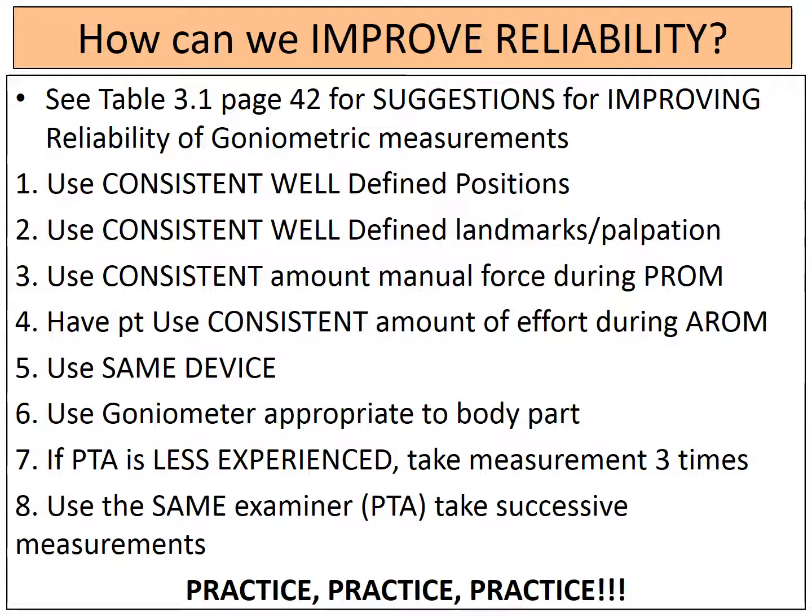You want to think about if you are doing passive range of motion that you are using the same amount of force to get at that end range of motion. Where it might become a little bit complicated is if your patient's in pain and how much are you going to push to get to that end range of motion. And if you're measuring it actively, is your patient giving you the same effort every time? And that's another thing that you want to encourage so that you have improved reliability.